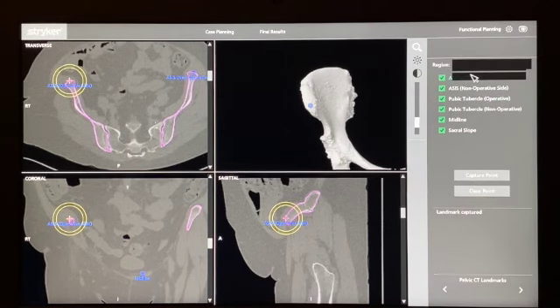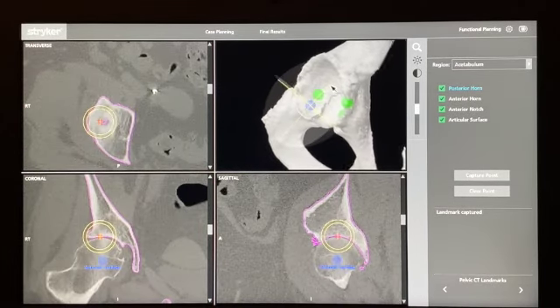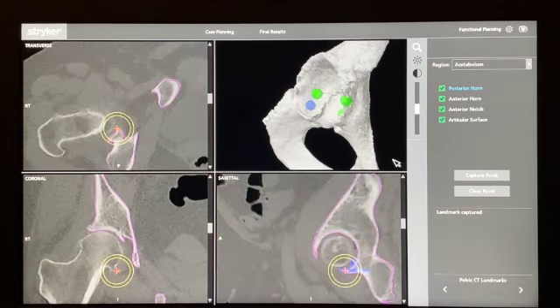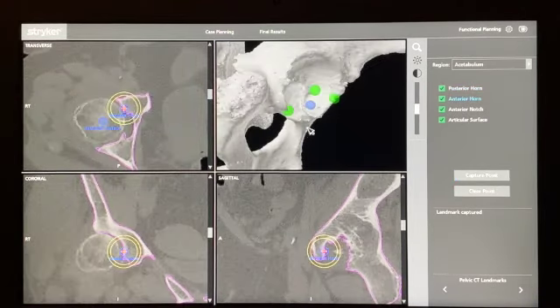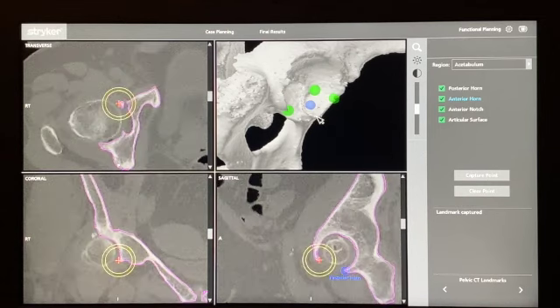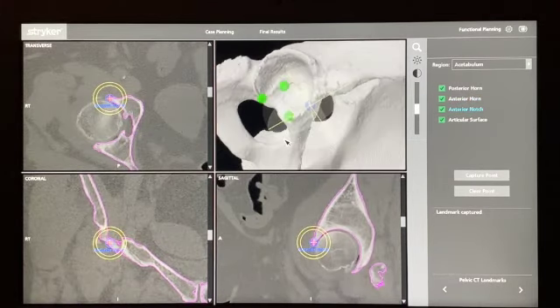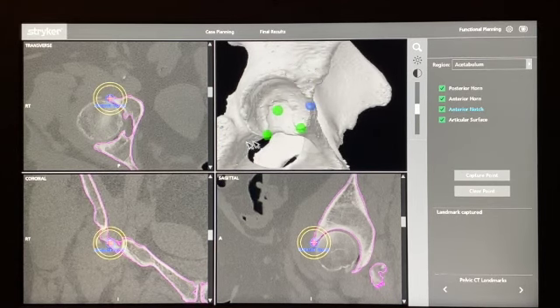When looking at your acetabular positioning checkpoints, I try to put the anterior and posterior horn in a place that will be easily identifiable. For the posterior horn, I move the point right onto the tip here, and similarly with the anterior horn landmark. I'm confident that during the operation I'll be able to check these two landmarks and get the accurate registration we need.